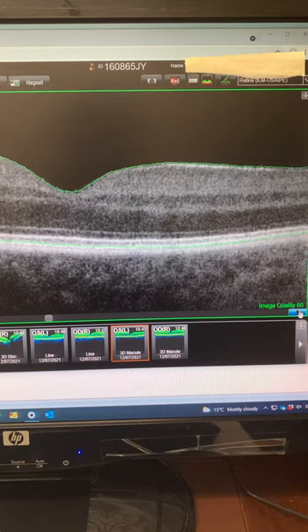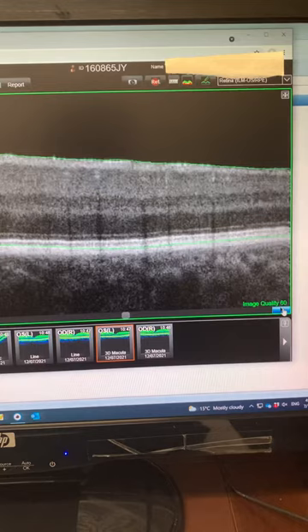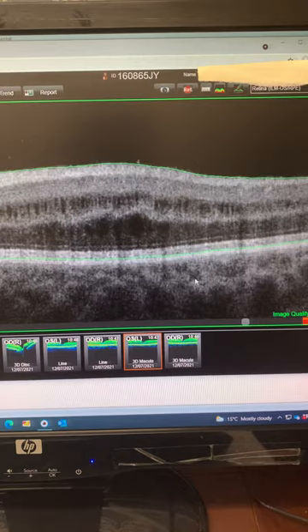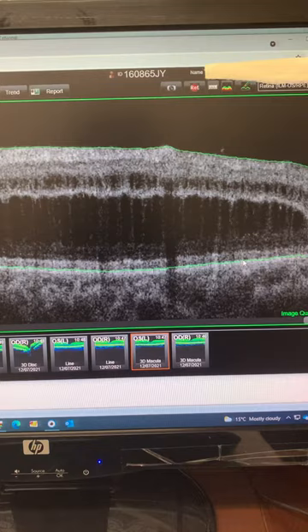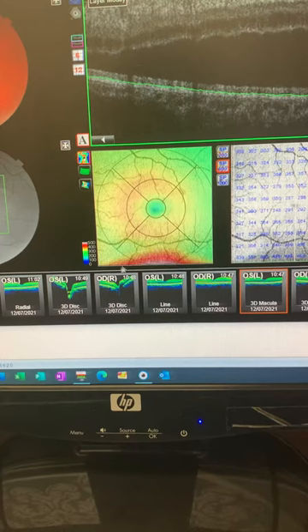What we start to see is some separation and splitting in the layers of the retina. This here is turning into a retinoschisis — we're getting all of this stretching and splitting of the retina, which is definitely not normal.